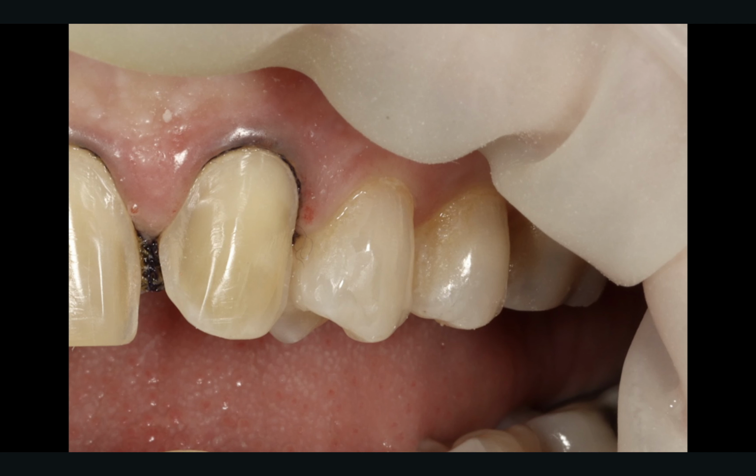This is a classic example of using it chairside as essentially a quality control digital prep analysis. So this case, it was a lady who came in, she had some darker stumps, and so prior to prepping, I said to the lab, after they'd initially seen her for a shade matching prior to the prep, how thick do you want this to be? How much material do you need? How much reduction do you need for that proposed design? And they told me 0.8 millimeters would be perfect.